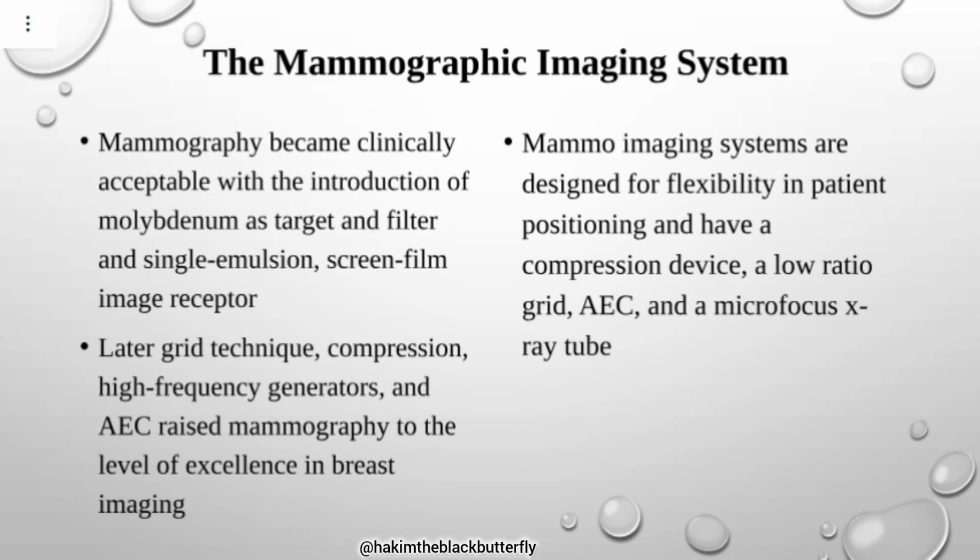This target filter combination in mammography plays a very important role because, first of all, breasts differ in thickness. There are ladies without breasts, others with thin breasts, others with medium-sized, large, and extra large. So you cannot use the same target filter combination on all these sizes. The size determines which target filter combination you are going to use.